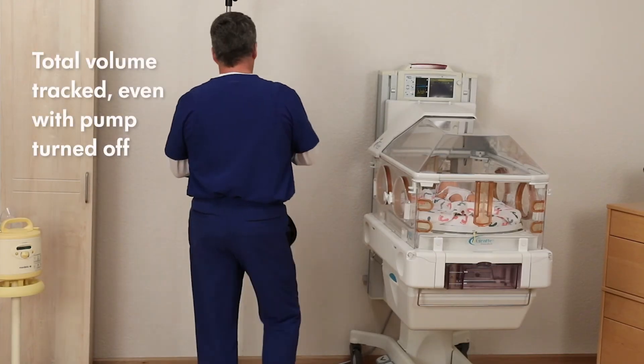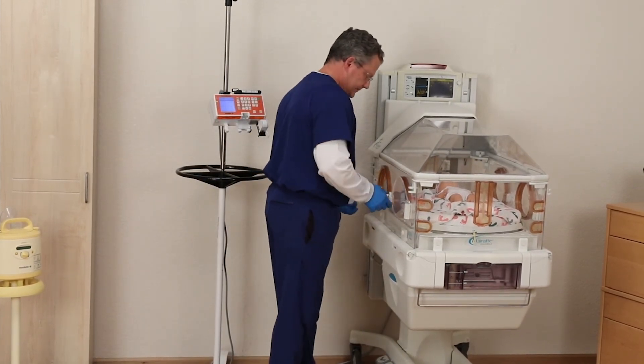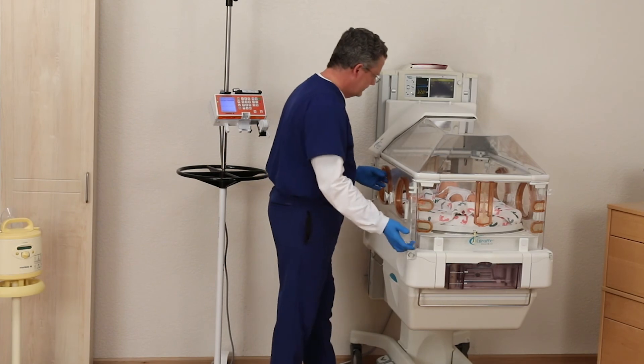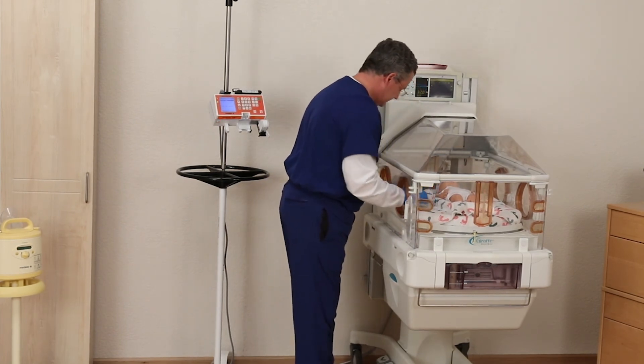The pump will track total volume delivered even if the pump is turned off between feedings. You can easily reset the volume to zero. Before the feed or while paused, push the reset zero button. Then select yes or no.